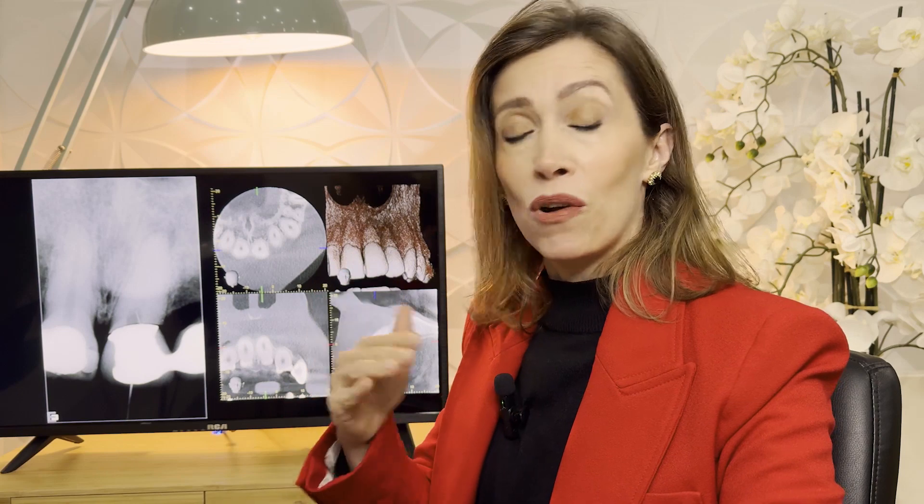So when you notice radiographically that you are over the canal but you can't find it, don't proceed, because you are probably going in the wrong direction. Most often you are going wrongly palatally and buccally — and that's the angulation you can't see on a conventional x-ray.